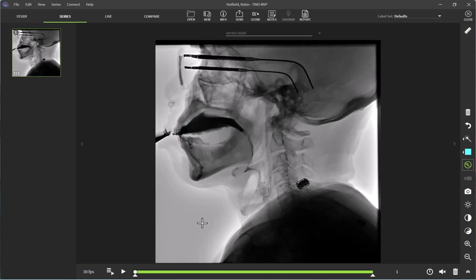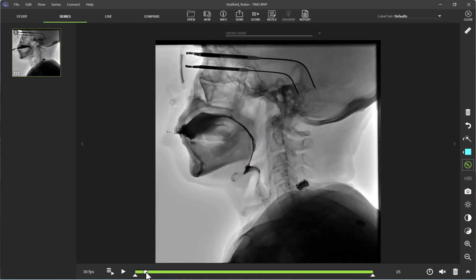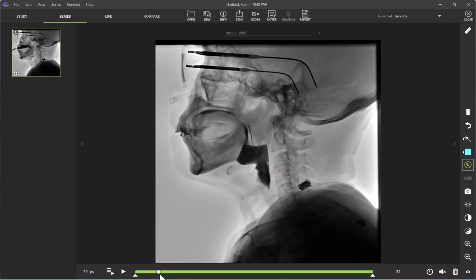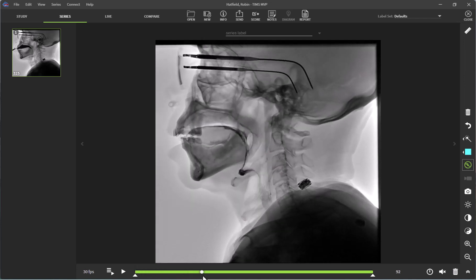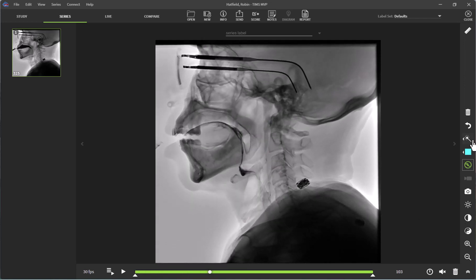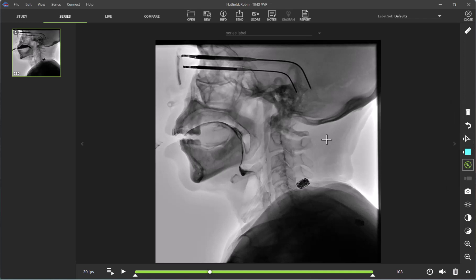Next, we are going to scrub through our video to the next aspect that I am wanting to measure. To do so, I am going to click on the circle icon here and scrub ahead. As you can see, after the swallow, the patient does present with residue.